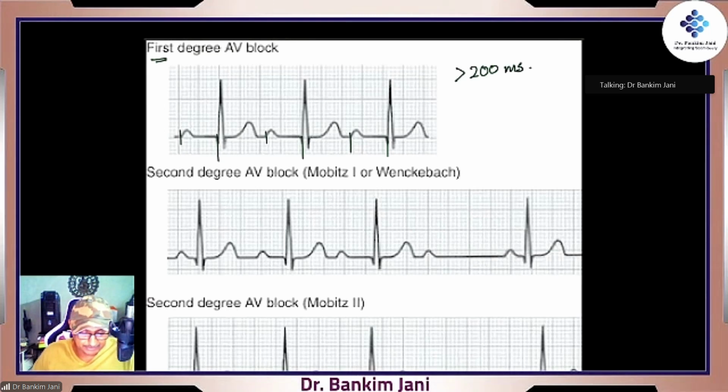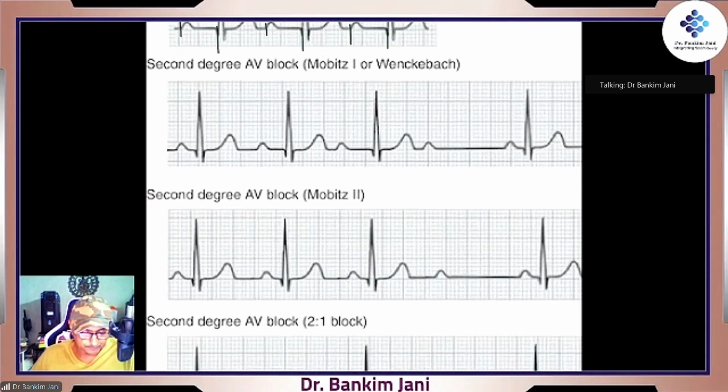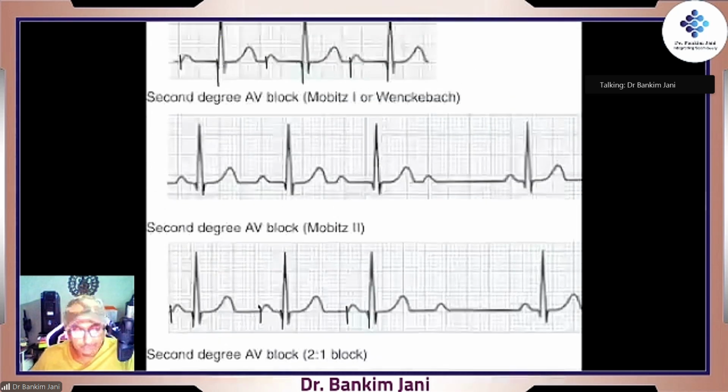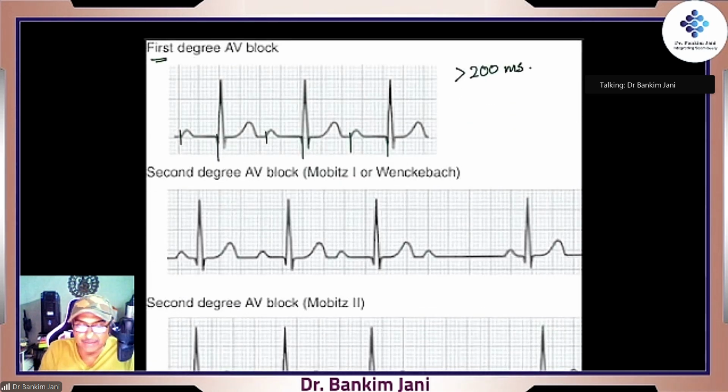But just now we said that here it is, here it is, here it is. Not necessarily say PR interval is more than 200 milliseconds. It is more than 200 milliseconds in AV block first degree with no drop beat. Correct. No drop beat.